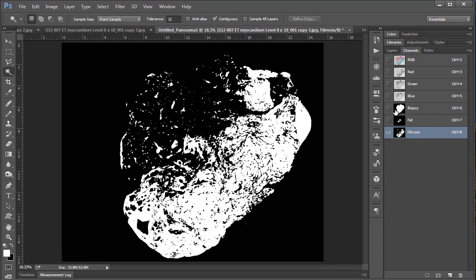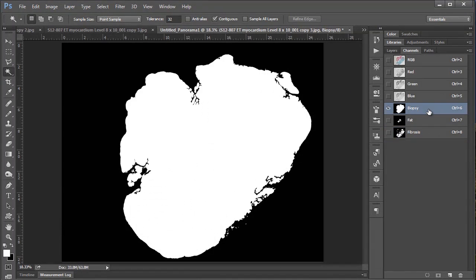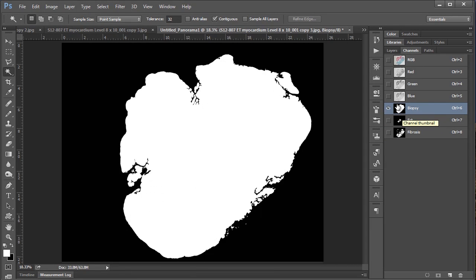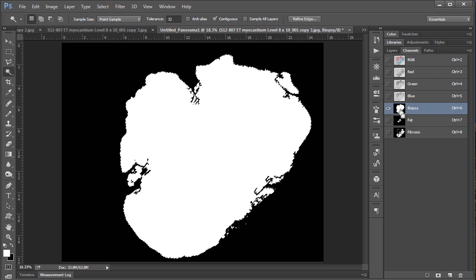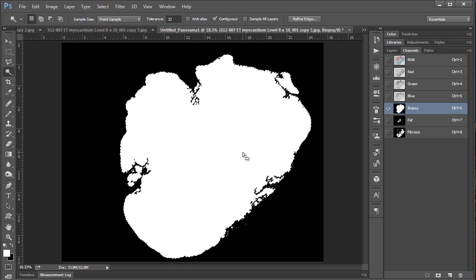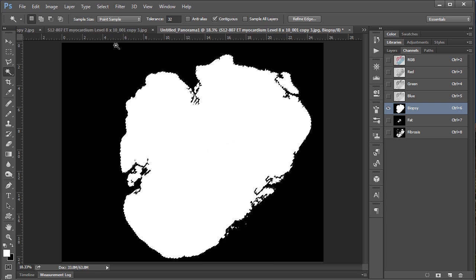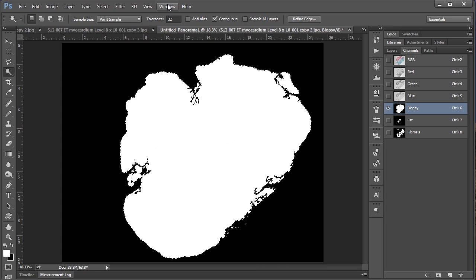So first of all we want to load up, we're going to start with the biopsy channel. We want to load that up and we want to load the selection. So to do that you hold control and click on the little icon here in your channel. And so that's going to load the selection of your biopsy. Now we want to go to window and load up the measurement log.